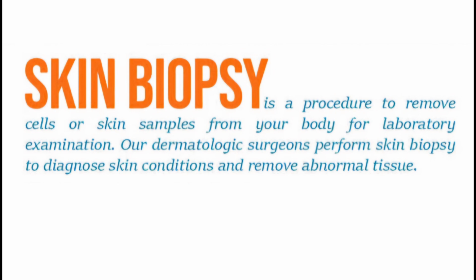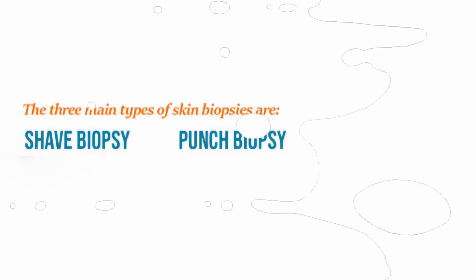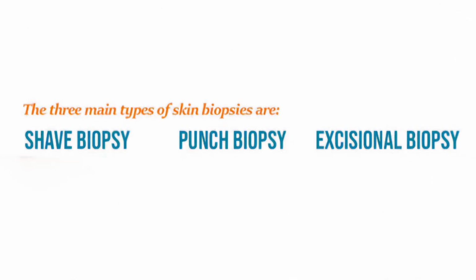It can be done in various dermatological conditions as well as various genetic disorders. The skin biopsy sample can be used to diagnose the disease. There are three main types of skin biopsy: punch biopsy, shave biopsy, and excisional biopsy.